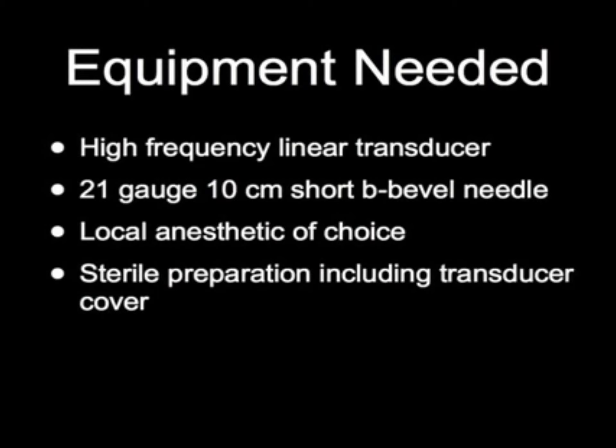Equipment needed: a high-frequency linear transducer, a 21-gauge, 10-centimeter short B-bevel needle, local anesthetic of choice, and a sterile preparation including transducer cover.